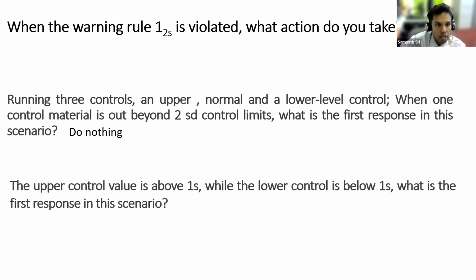Second question is, running 3 controls, upper, normal and lower level control, when one control material is beyond 2SD control limits, what is the first response in this scenario?